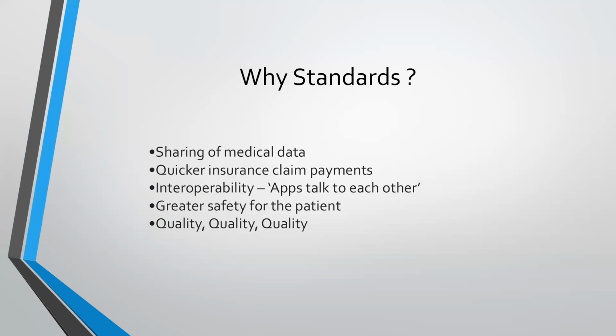So why do we need this standard? I think we have the answer by now. If there is no standard, everyone will try creating their own message structure, and that is a time consuming process. They have to conclude on the format, they have to conclude on the structure, they have to talk about what they are sending where.